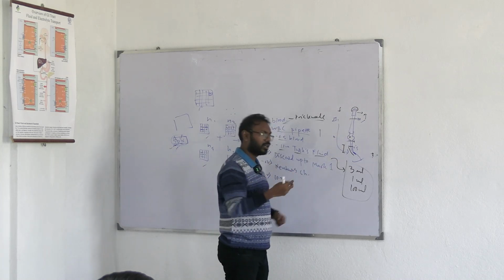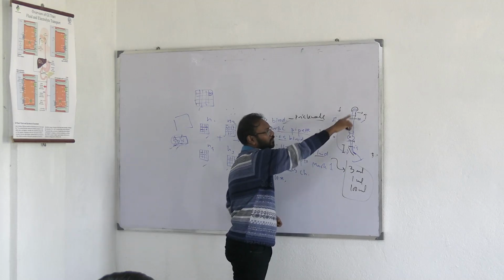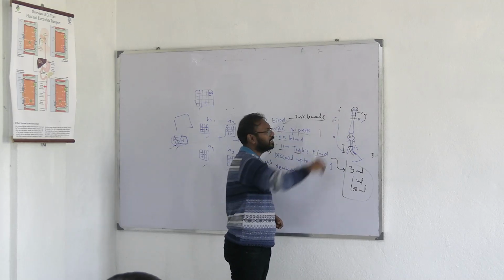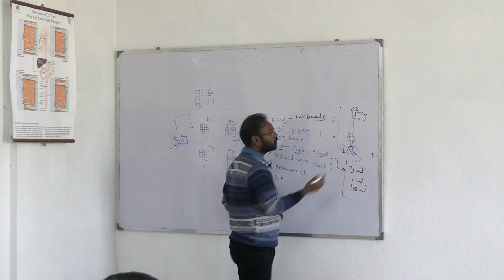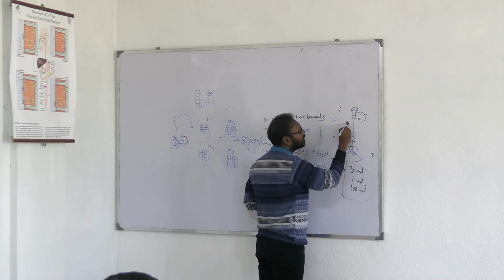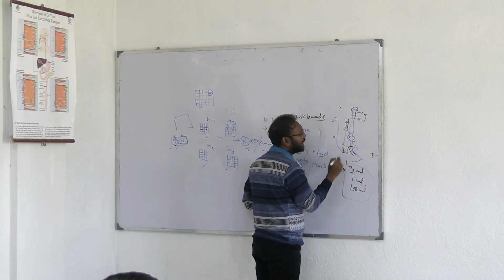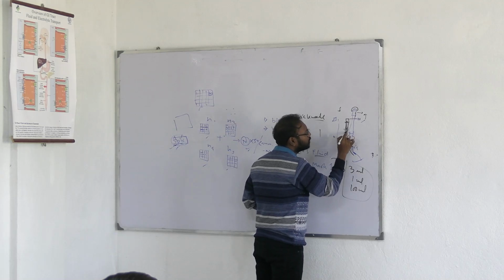Yesterday what happened was that quite a few people sucked hard, so it went above 11. The fluid was more and then they discarded it, but a little bit of fluid had already mixed with the blood. Now when you suck it, the blood will go upwards. So after you have taken the fluid, the blood will be there, and the fluid will be there because you took the fluid later. So this will be your fluid.